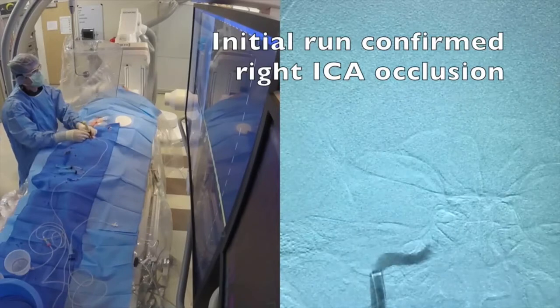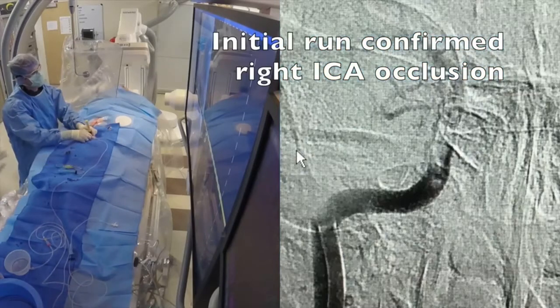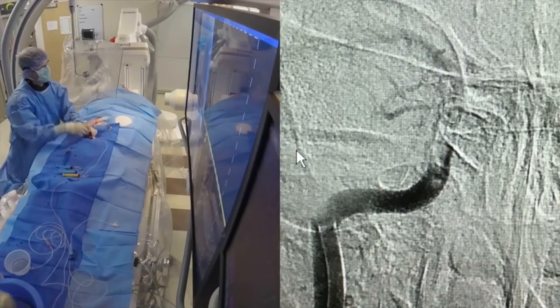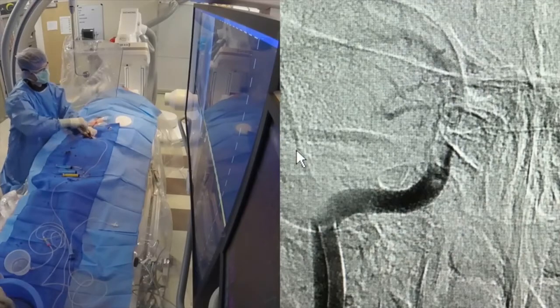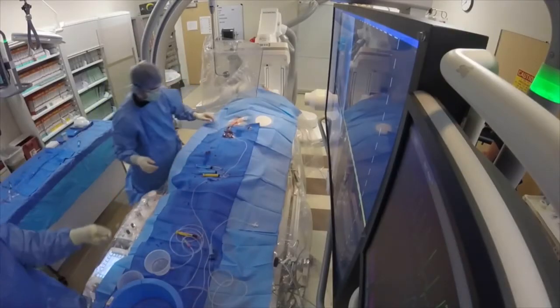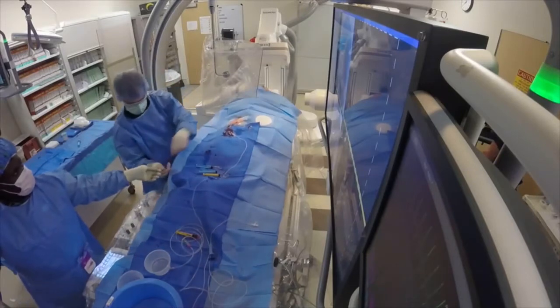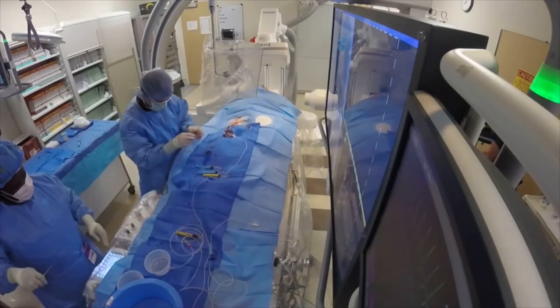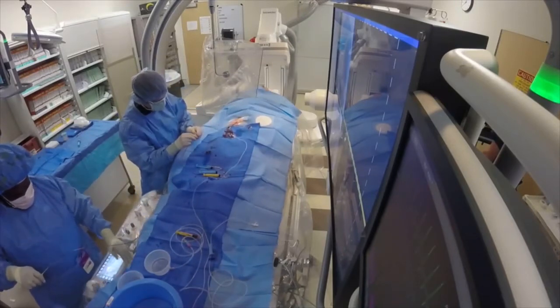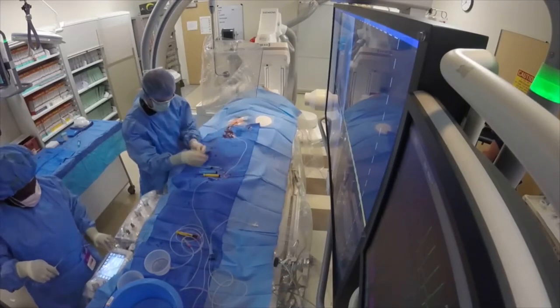All we're doing here is setting up for an angiogram — a view of the blockage and the blood vessels in the head and neck. Here we can see that there's a clot in the carotid artery as it's going into the skull.